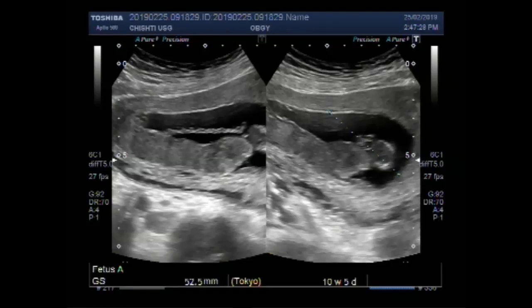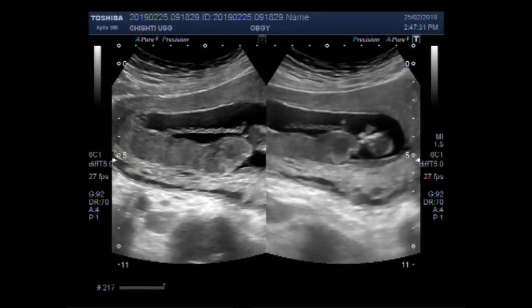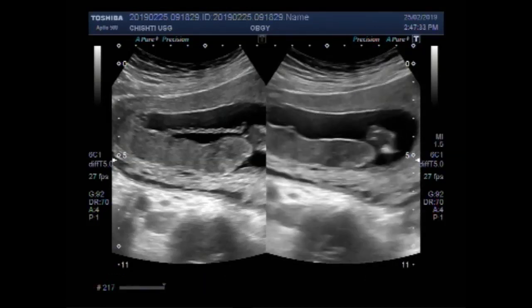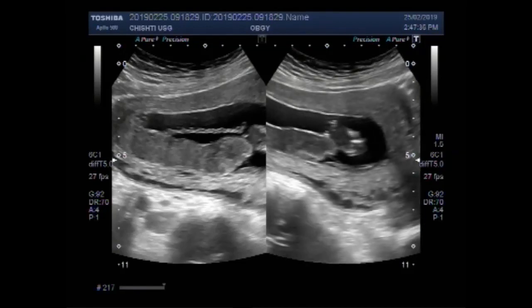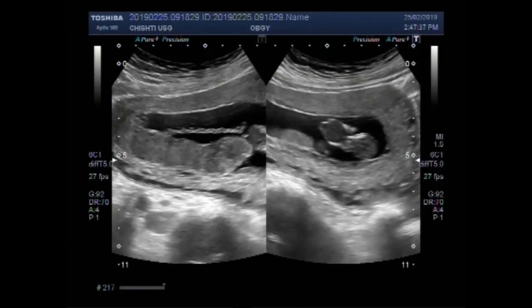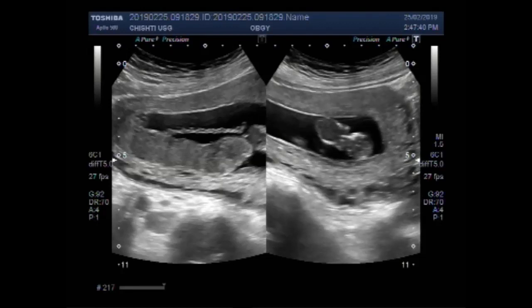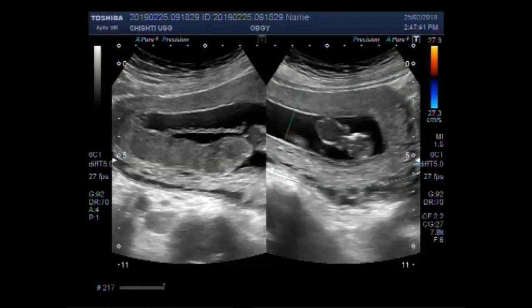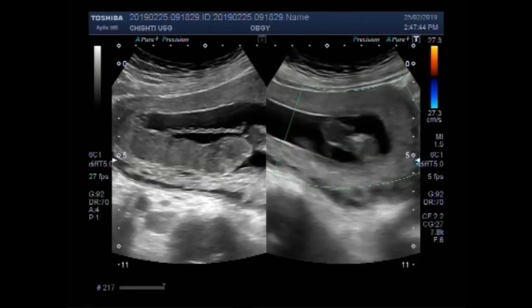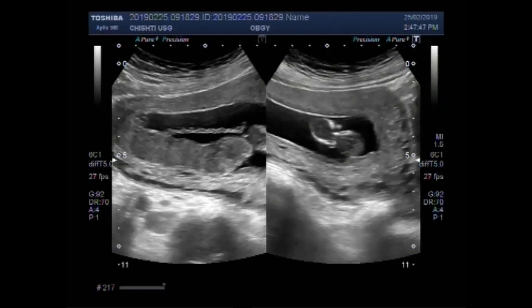Now this is the measurement of the gestational sac and the fetus.